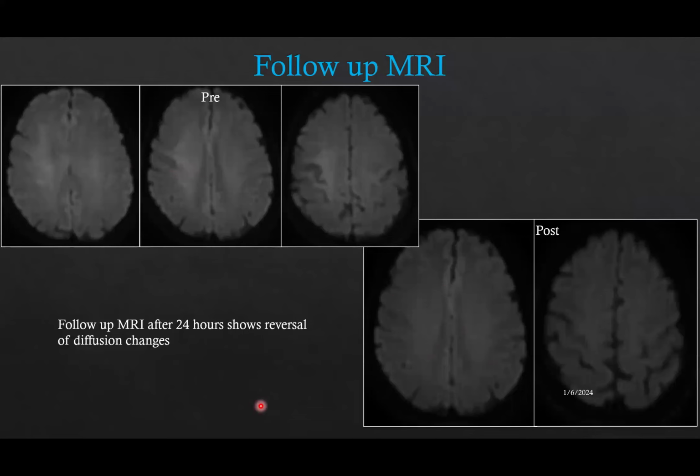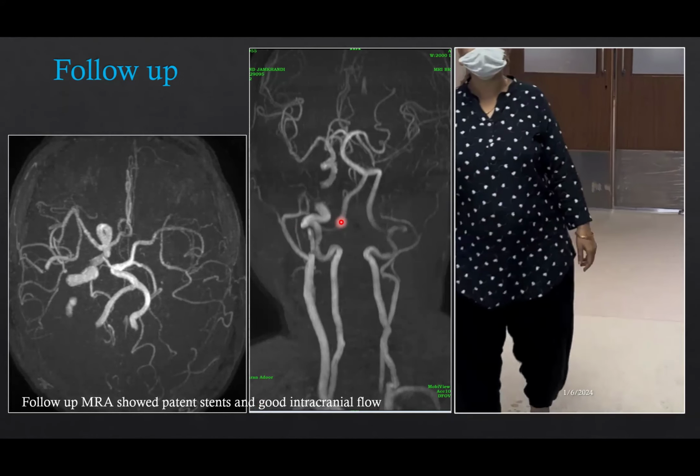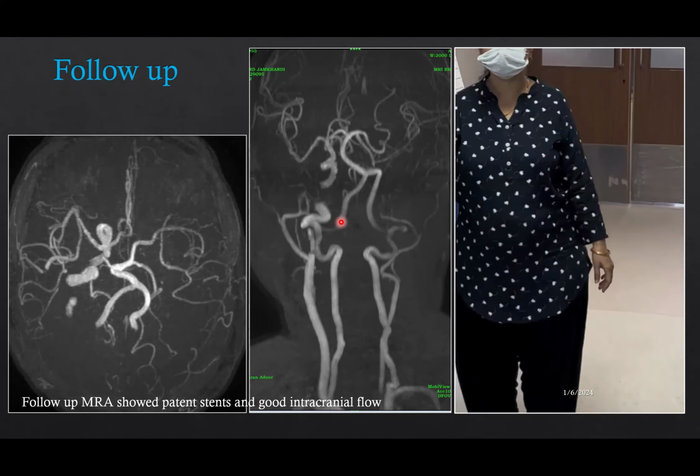And this is an angiogram just before discharge, and the patient on the first follow-up. She had complete recovery without any deficit, with the angiogram showing persistent opening of the neck and intracranial vessels.